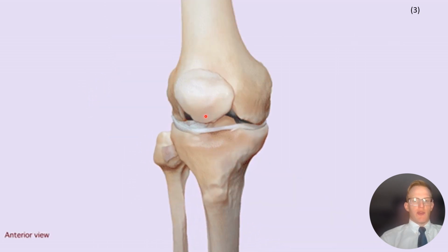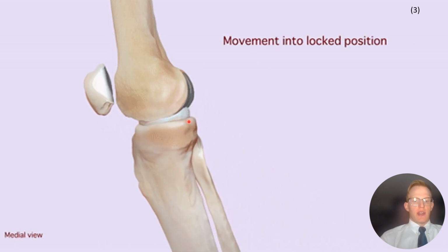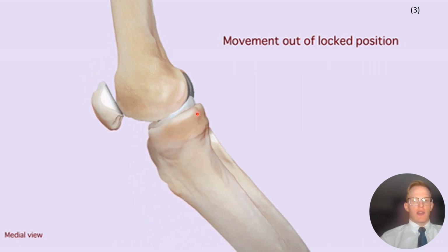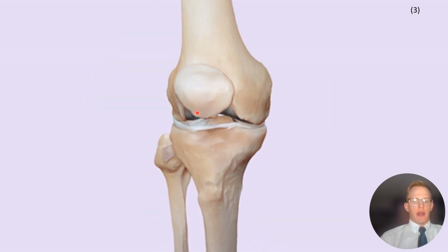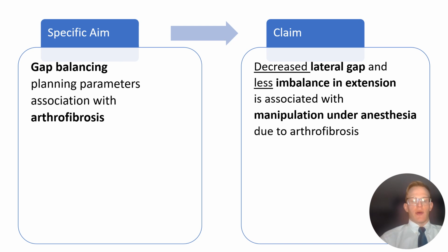At the beginning of flexion from full extension, the lateral femur externally rotates on the tibia around the medial compartment. The knee unlocks from the position in full extension to promote proper tracking of the condyles on the plateau in mid to deep flexion. During Navio Imageless Robotic-assisted TKA, the surgeon can modify cut thickness, rotation, and alignment to modify the gap balancing plan. Robotic-assisted technology with the Navio allows for storage of operative variables which are not often measured or saved in conventional TKA.